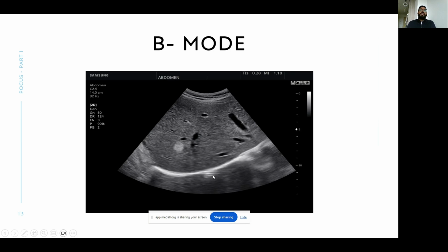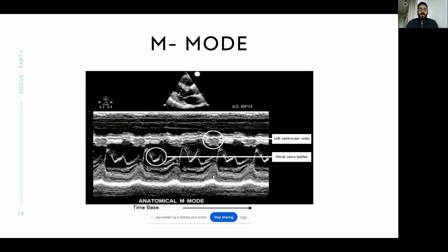Okay, so whenever you are doing ultrasound, now this is not as easy when I'm explaining it with just pictures, but if you have a chance while you're doing your clinical rotation, if you see an ultrasound machine after the class, go and look at the various keys there are, various transducers that we'll be discussing today. See how each of them is held, and depending on where you hold it, it will decide how the image comes up. And you need to have that three-dimensional visualization within your head to understand this 2D image. So there is a limitation when I'm discussing those scans with you, but I'll try and make it as simplistic as possible. So the next thing is something called M mode.